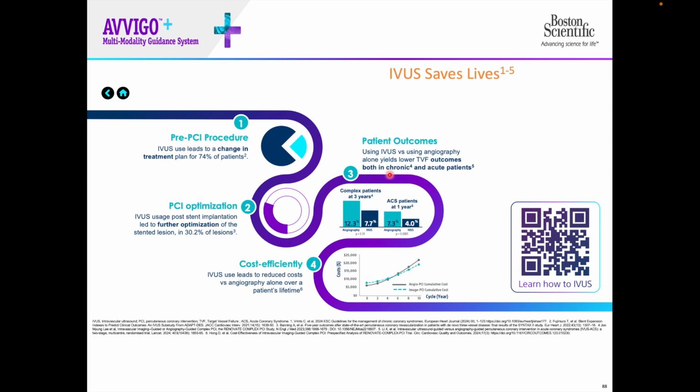Using the IVUS versus using angiography alone yields lower target vessel failure outcomes both in chronic and acute patients, if you see here. And then it is more cost effective as compared to the angiography alone over a patient's lifetime.